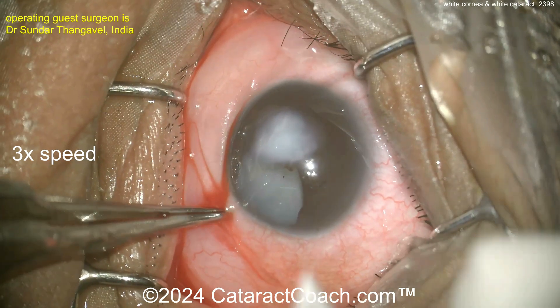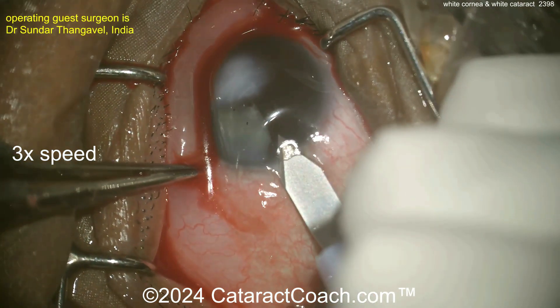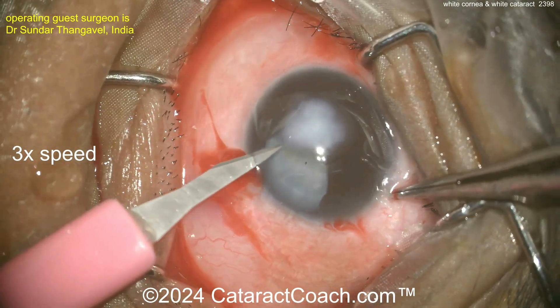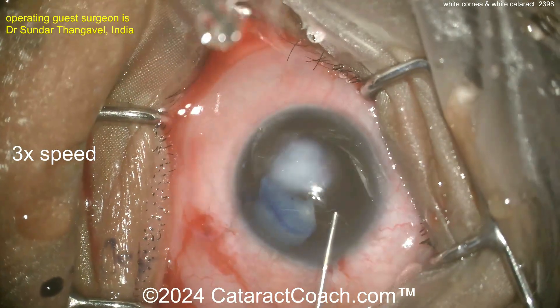Look carefully here. You can see there's a corneal leukoma, there's iris damage, and there is a white cataract behind that little poke of iris. Going inside here, it looks like there's some corneal adhesion with the iris there.